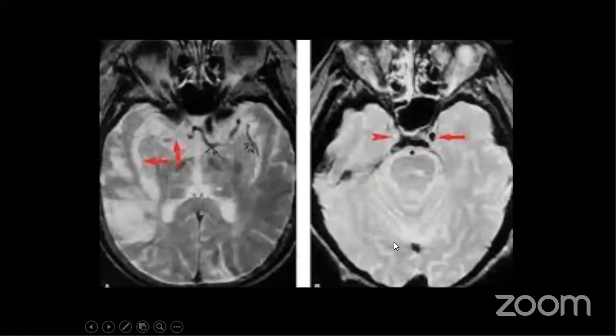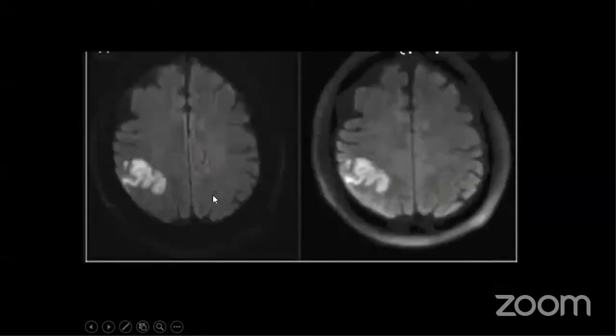This is a very early sign. I'm just showing you what is called loss of flow void that you can see in an acute stroke. You see these flow voids, right? So you see the loss of flow void here. That means there is some embolus that has caused this. This is a diffusion weighted imaging showing the hyperintensity with a very territorial hyperintensity. This again is typical of an acute stroke.